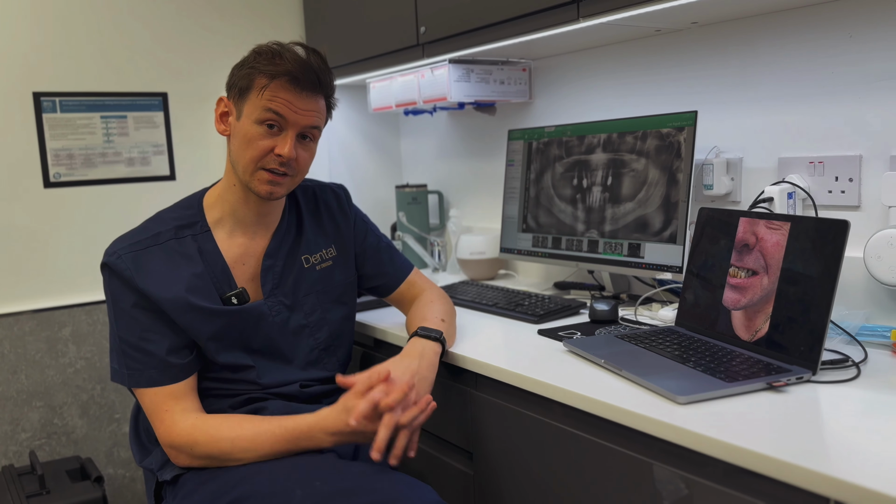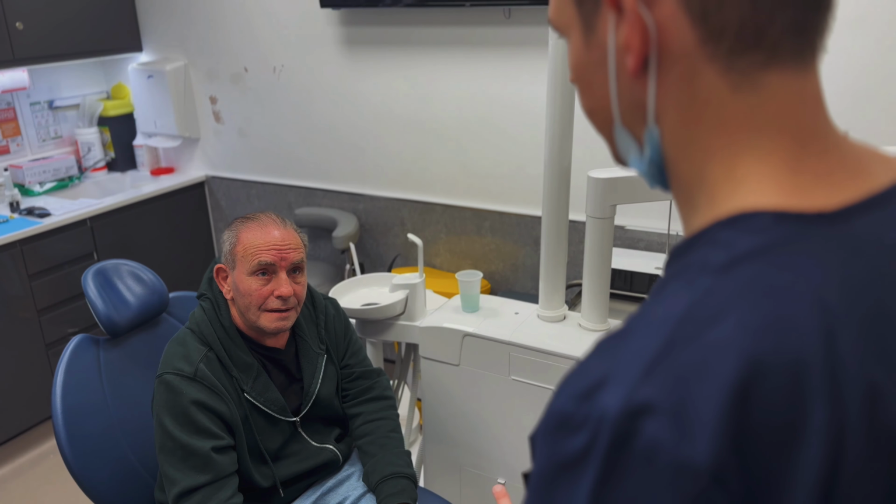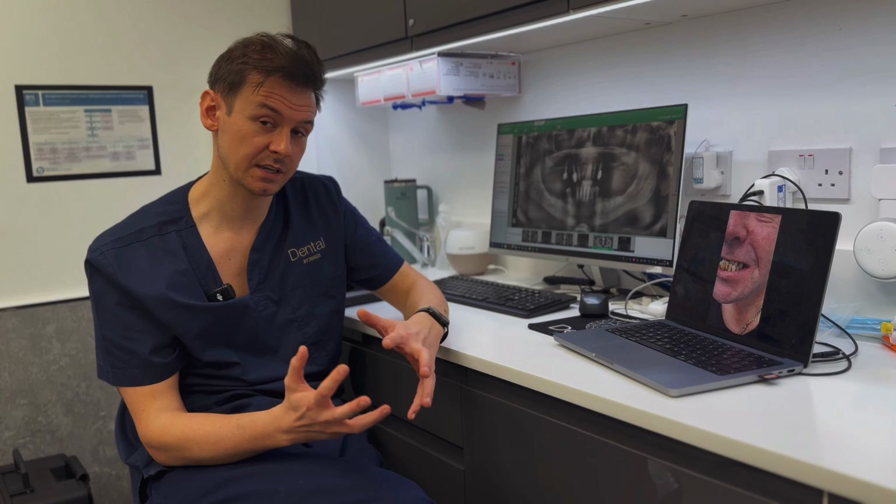So we delivered his new smile. The whole process took about 5 hours from start to finish, and he will be coming back in a couple of weeks where we'll be able to see how everything's looking. Do we need to make any little adjustments before we proceed to the finals?